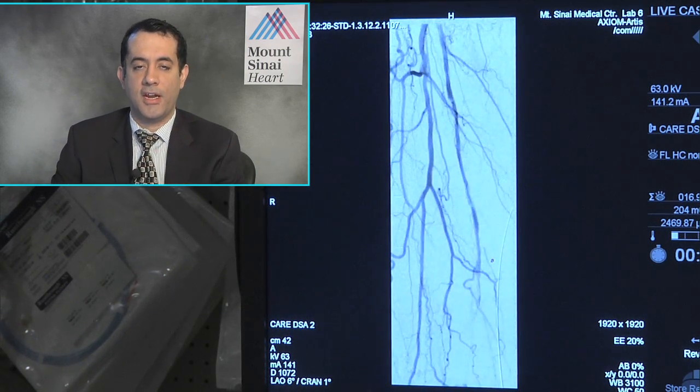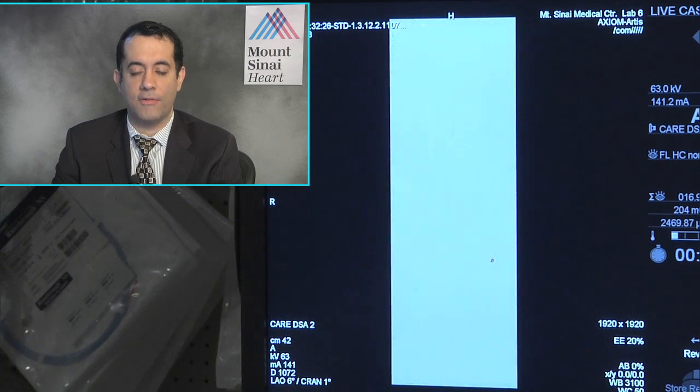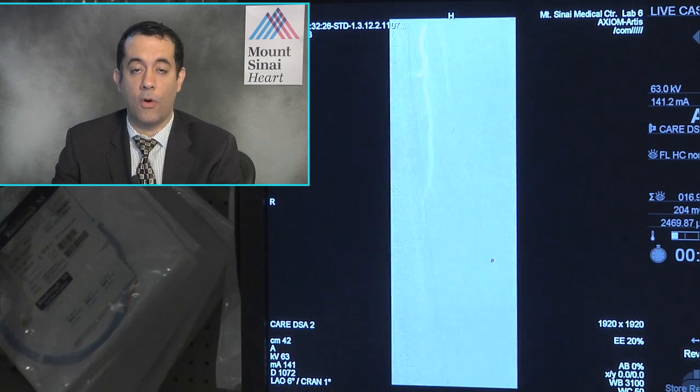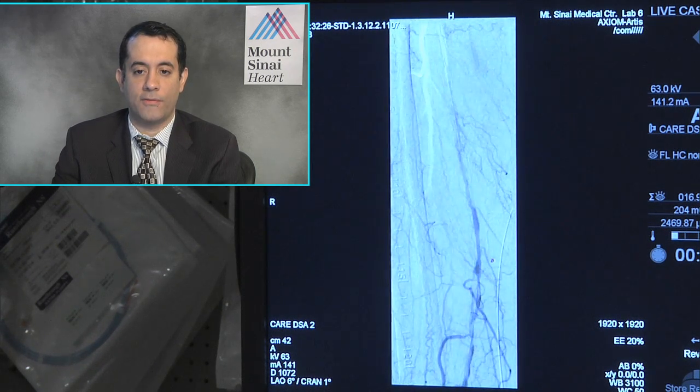Okay, sorry. The data presented by Sachin is pretty impressive. Keeping in mind all the modalities we have, like DCB, Supera, DES, with the patency running anywhere between 79.3% all the way to 93% is very encouraging, especially for patients like these who have claudication.